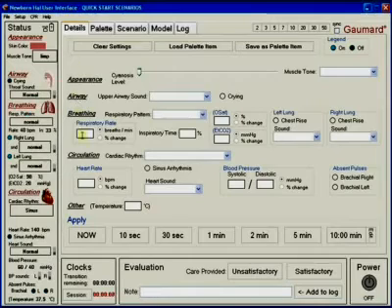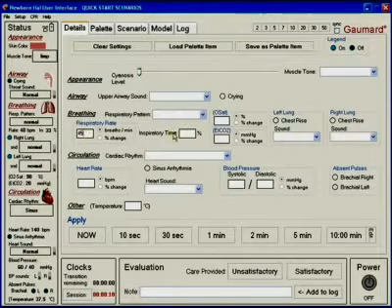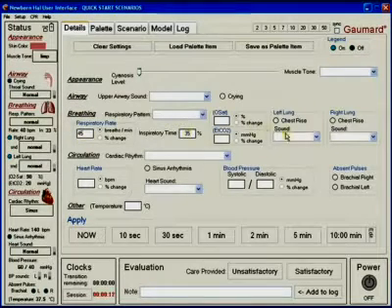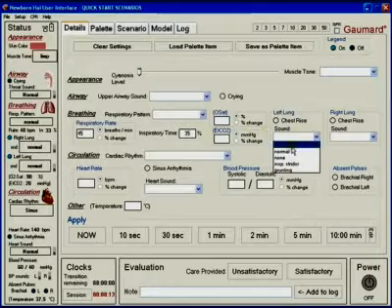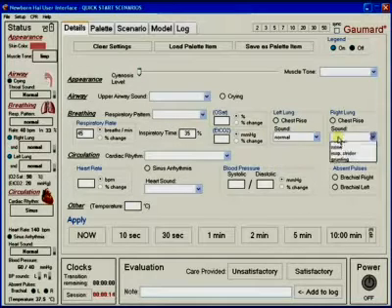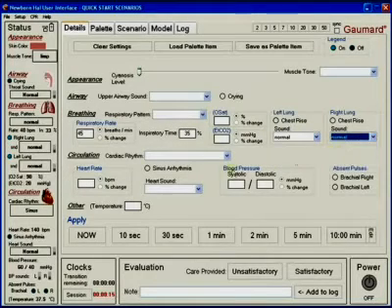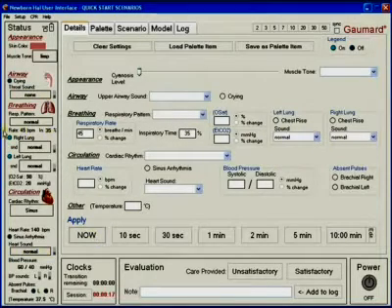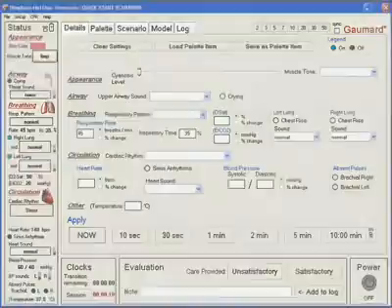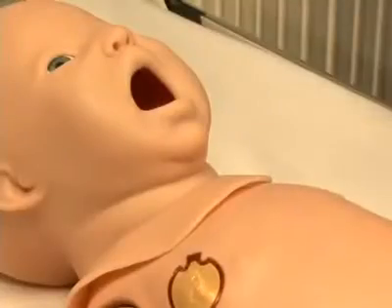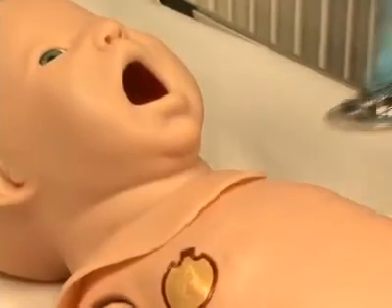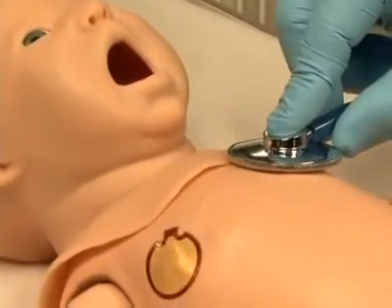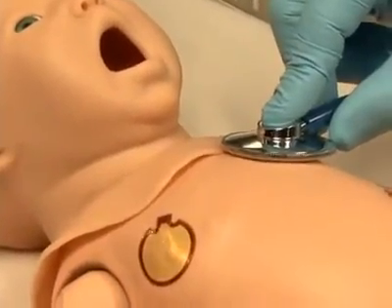Newborn HAL can easily control rate and depth of respiration and choose independent left and right lung sounds, which are synchronized with selectable breathing patterns. Multiple sounds are available.